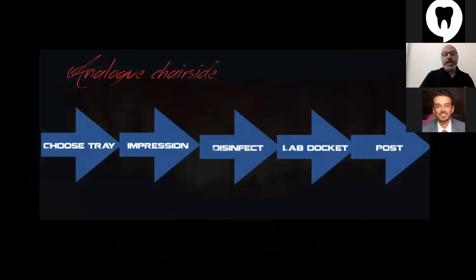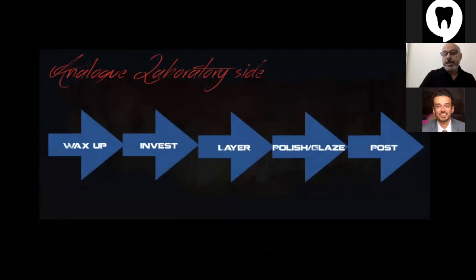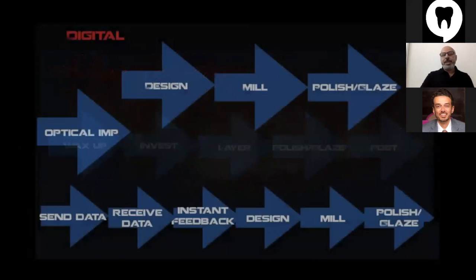Whether you're going to take an impression and send it to the lab or otherwise, at the end, it will take lots of steps to finish everything. And of course, digitally, it will be much easier.